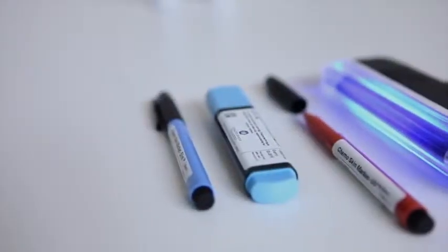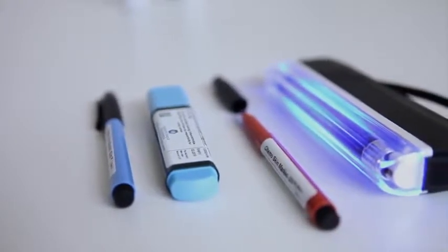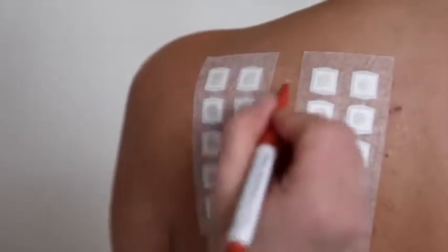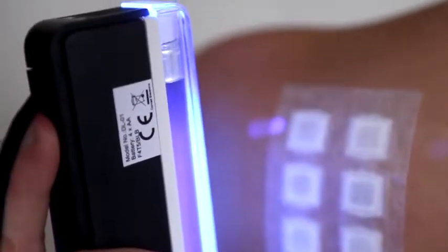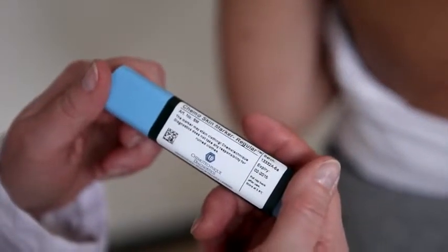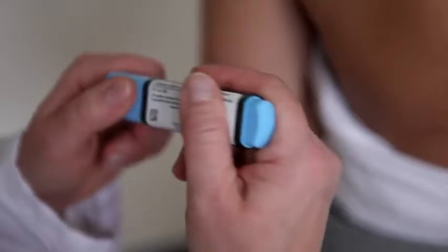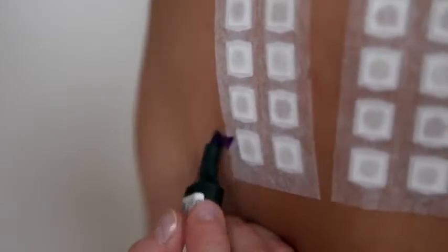Chemotechnique offers three different skin markers. The Chemo Skin Marker UV is preferred when marking dark skin or when visible markings are not desired. Use the UV lamp to make sure that the markings are visible. The marker used here is the Chemo Skin Marker Regular with a broad tip. An alternative is the Chemo Skin Marker Slim, which has a narrow tip.